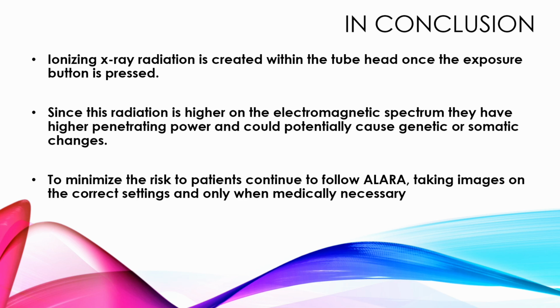And know that if we take an x-ray that we don't really love, but it will pass as far as being clinically able to read it, we're not simply going to just willy-nilly take over a zillion x-rays on this patient simply to get the perfect thing. We know that when we're taking x-rays, it's causing genetic or somatic changes at a cellular level on our patient. So we're going to do this wisely. To minimize the risk to patients, we're going to continue to follow the ALARA concept, taking images in the correct settings and only when medically necessary.